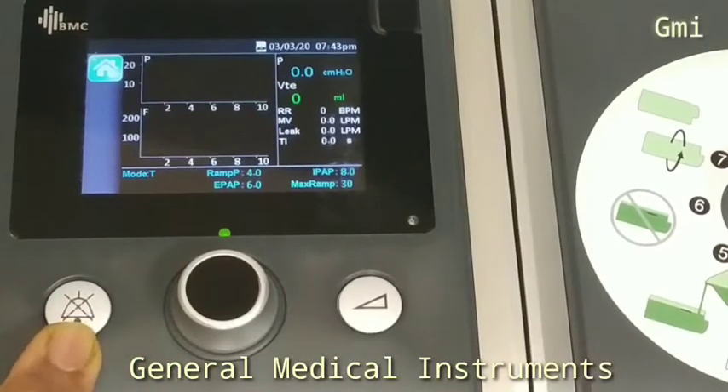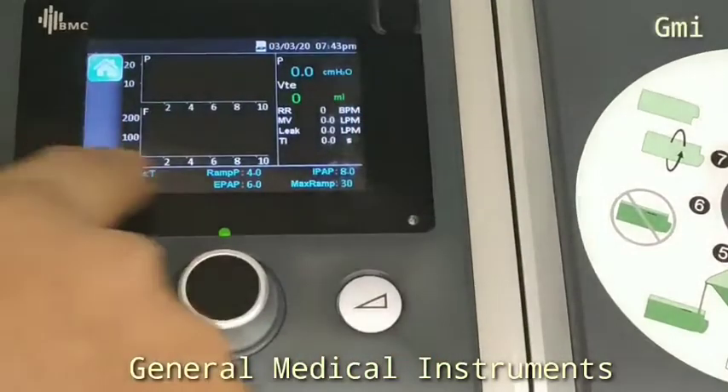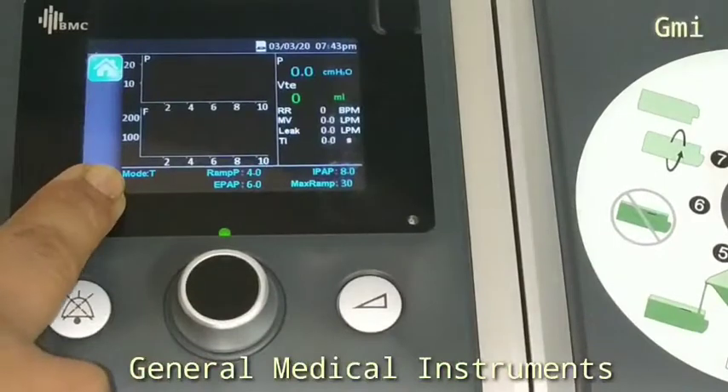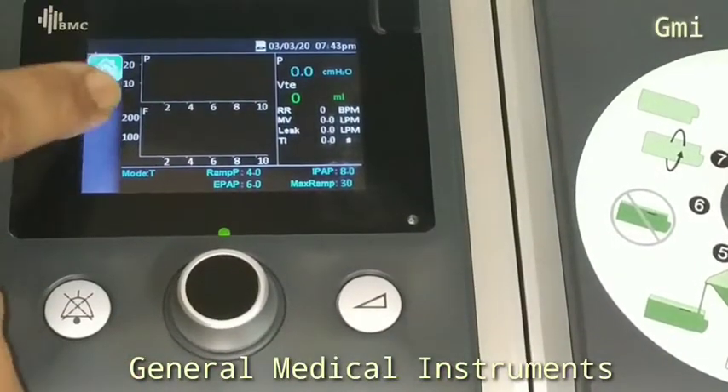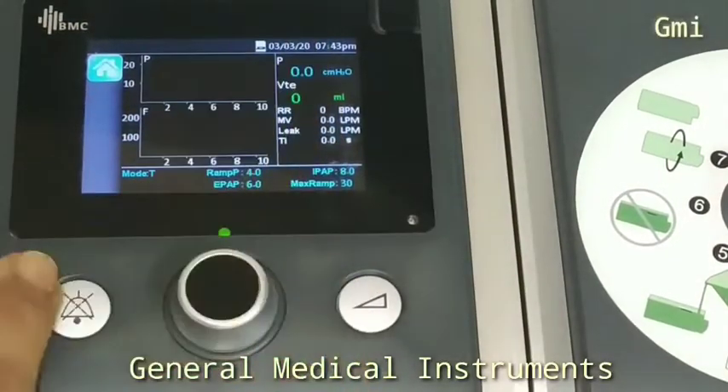Alarm Mute. Navigation and Enter Knob. RAM Button. 3.5 Inch Color Screen. Pressure and Flow Graph Window. And all patient parameters.